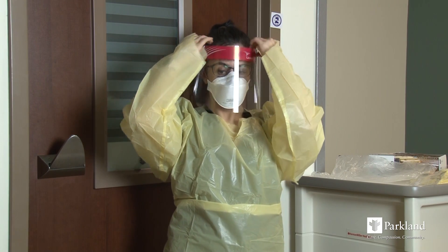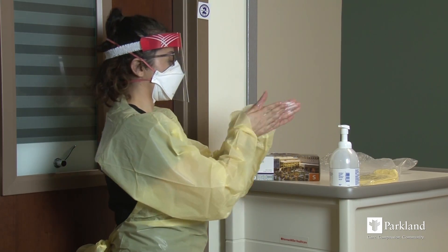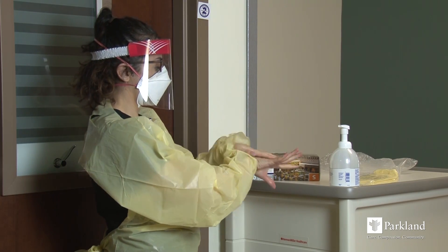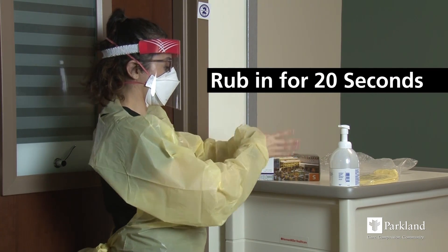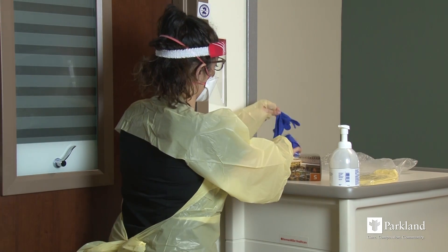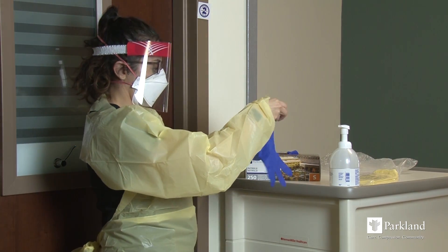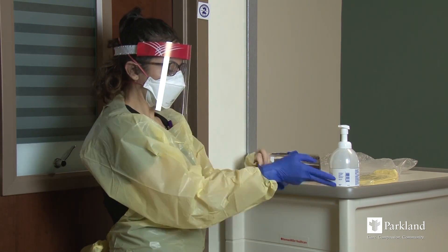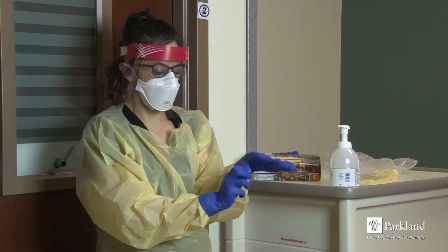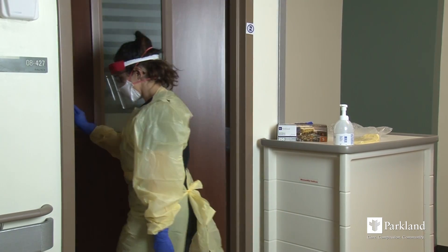Perform hand hygiene, as your hands were contaminated when touching your face and hair while donning the mask and face shield. With clean hands, choose the right fit gloves and put them on your hands, being careful to cover the wrist of the isolation gown. You are now ready to provide patient care.